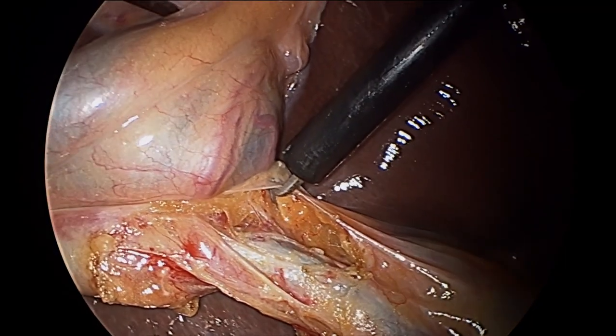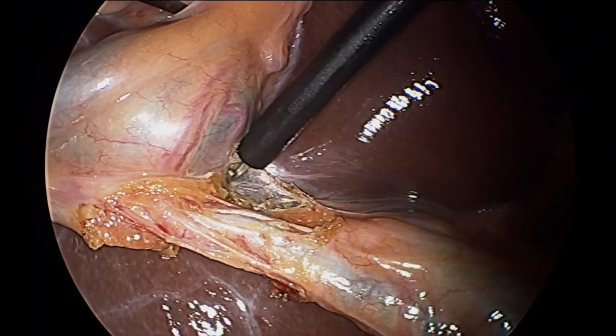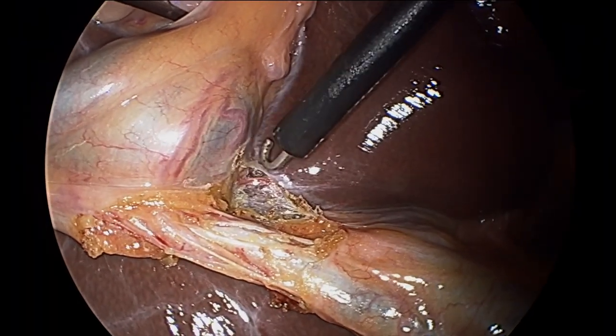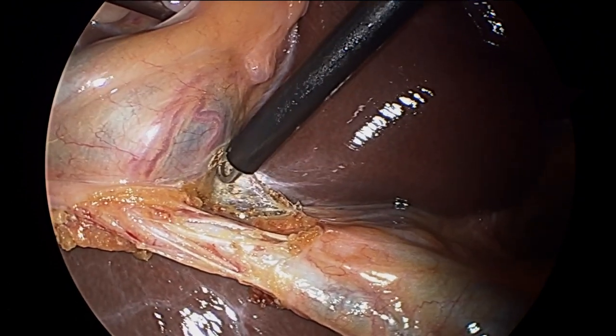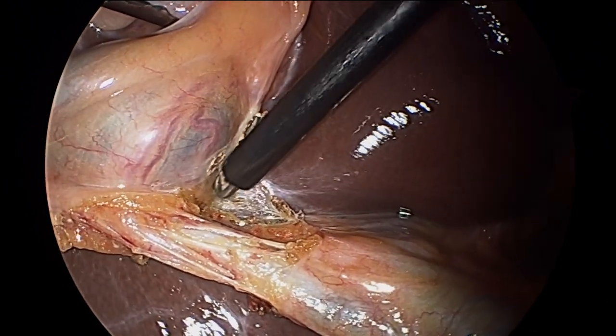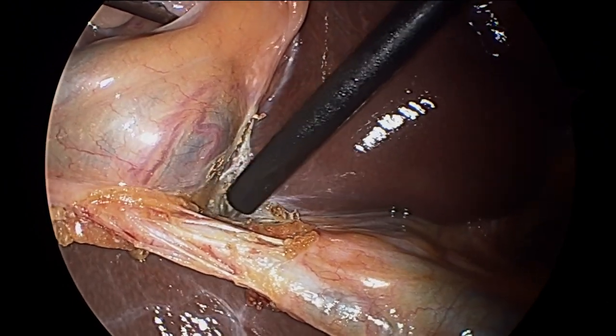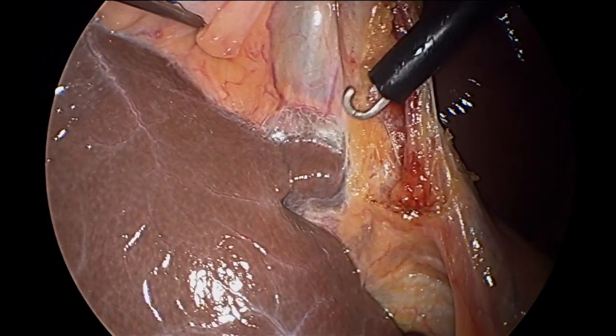Now you see the introduction of the hook cautery. That uses heat to cauterize the little capillary arteries — it prevents them from bleeding by passing down a current of electricity. And you see Dr. Helms separating the gallbladder from the liver bed.